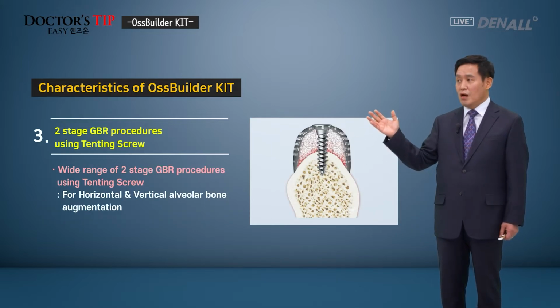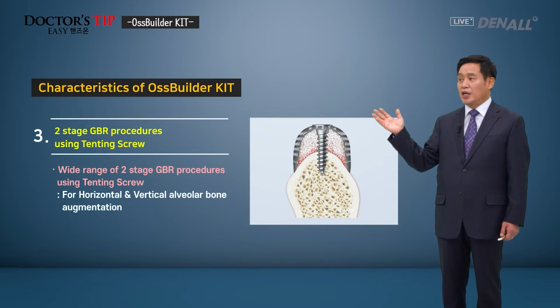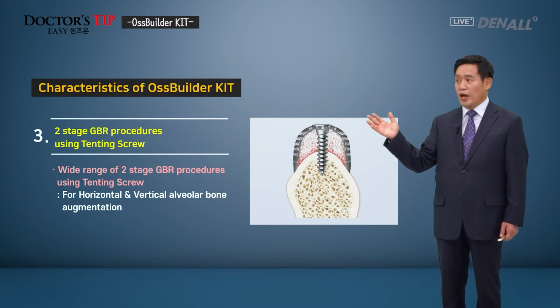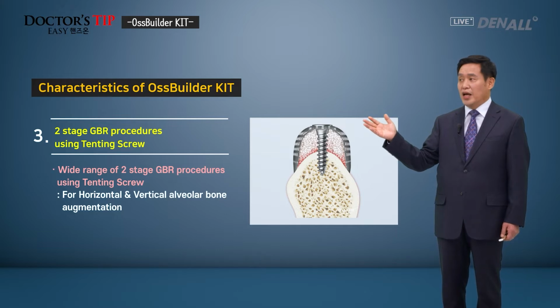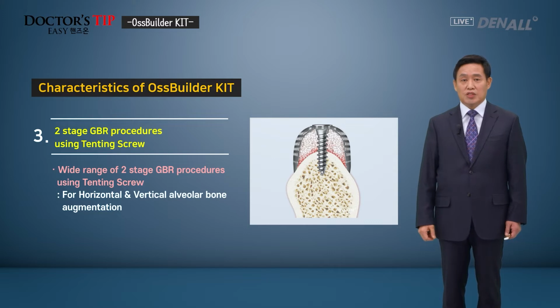Third, in the case where implant immediate placement is difficult, you can do GBR and then place the implant. You can use tenting screw to get horizontal and vertical augmentation in the alveolar bone.